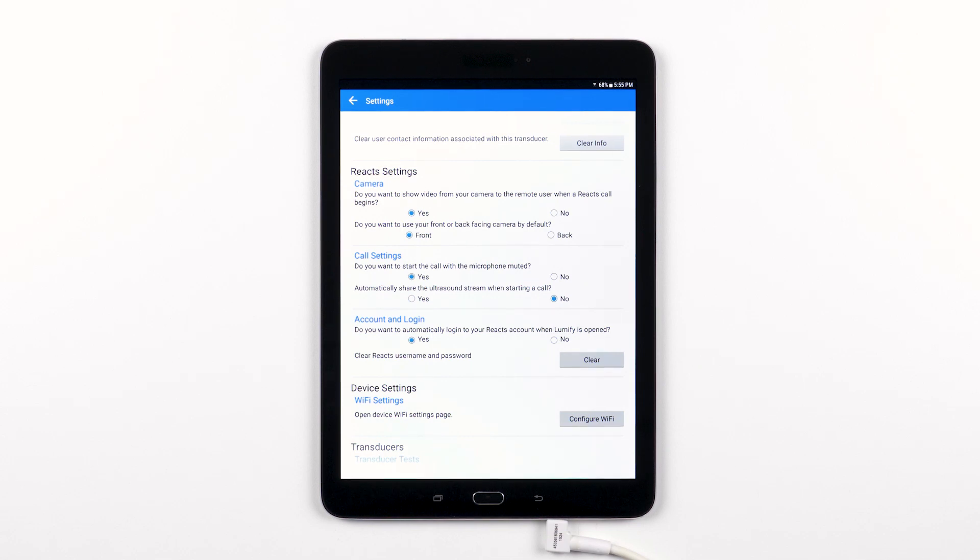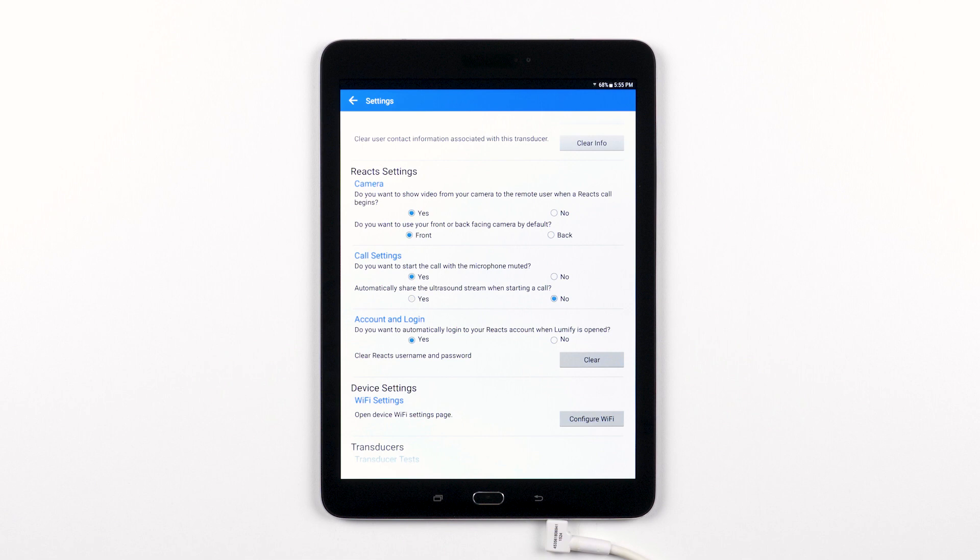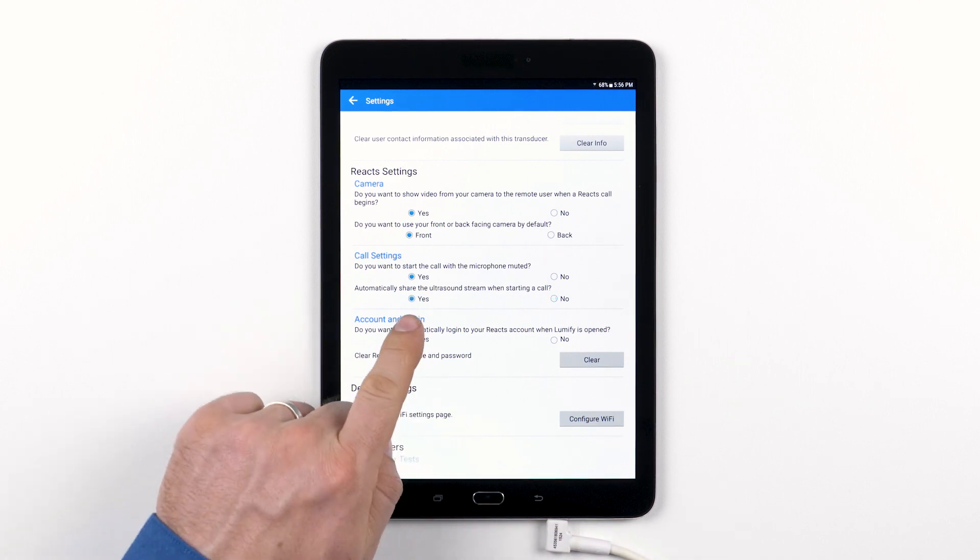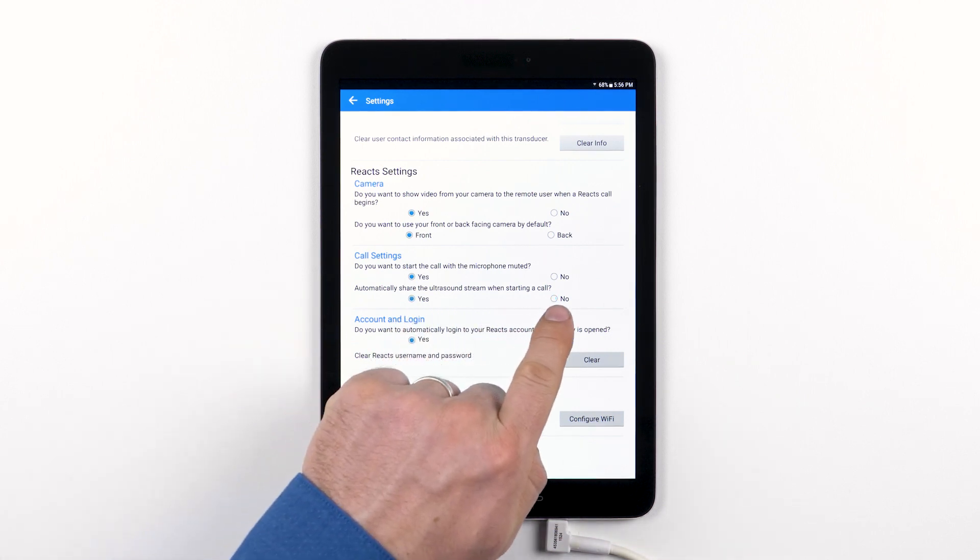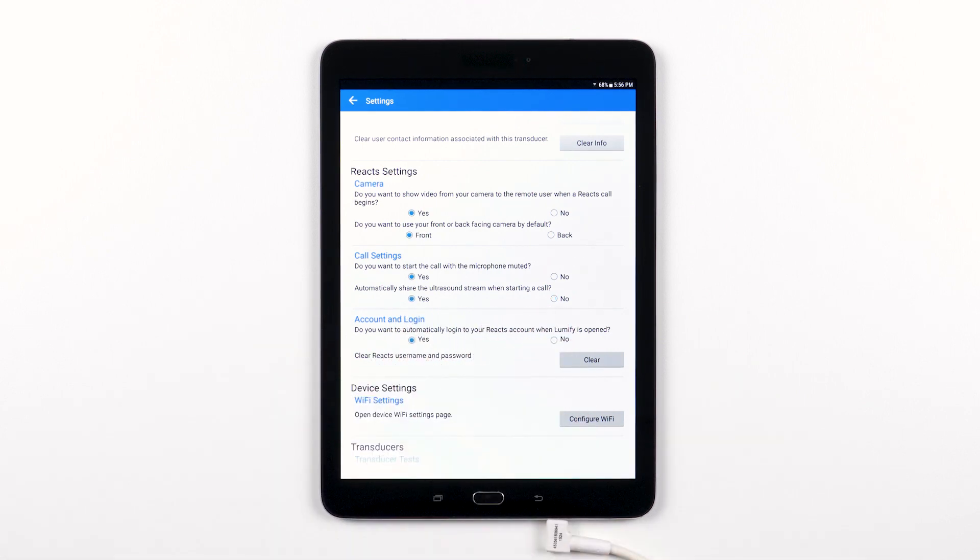Many users will like to have the microphone muted at first, just so they have the option to control what their remote users hear before they are ready to talk. You also have the option, yes or no, to automatically share the ultrasound stream when you start the call.